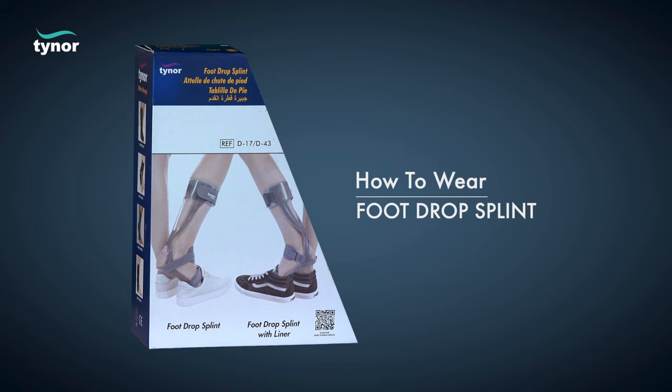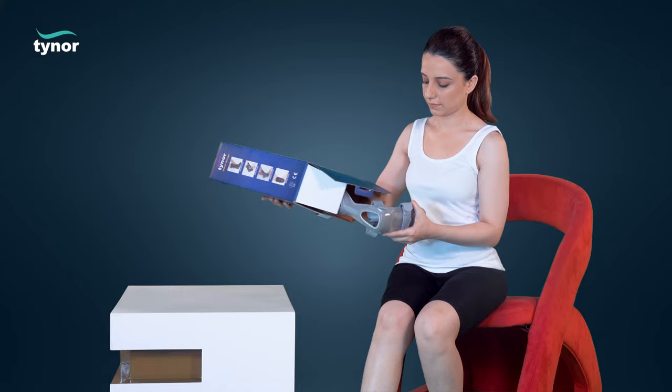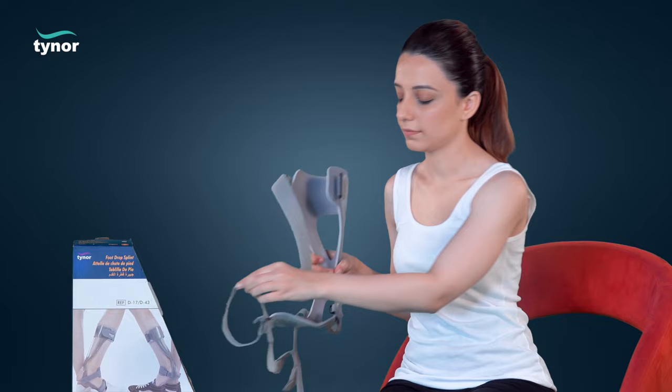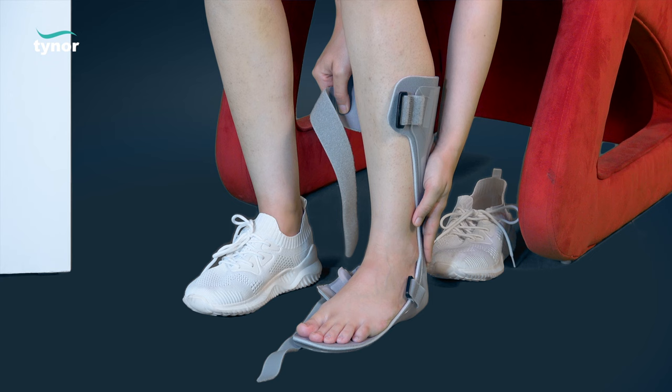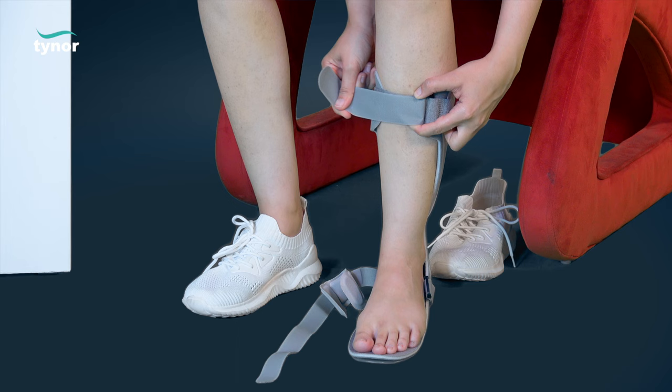Unfasten the hook loop closures. Place the foot drop splint in an upright position. Now place the affected foot on the plate of the foot drop splint and align the contours. Tighten the hook loop at the calf bay reverse buckle mechanism. Now tighten the ankle hook loop for proper alignment and grip.